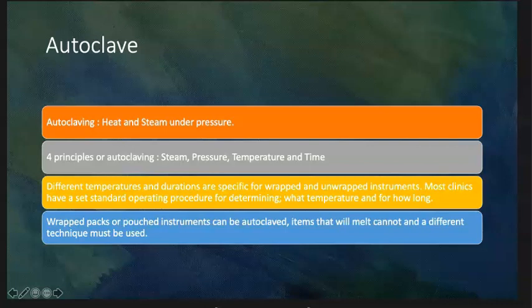We always want to make sure when we are placing down surgical packs on surfaces that there's no water on the surface. You will immediately contaminate your surgery packs should you place them in water, as the water will bleed through to the instruments. If you feel your surgery pack has been compromised in any way, it is important to re-sterilize your instruments. Failure to re-sterilize your possibly contaminated surgery pack could result in patient compromise or post-surgical infections.